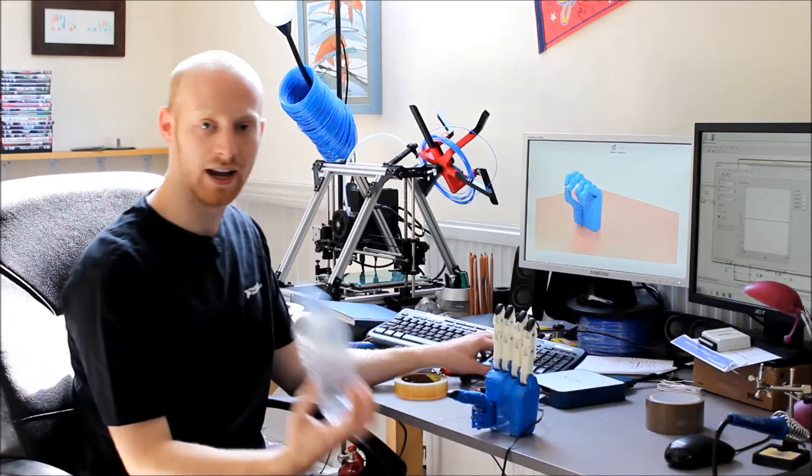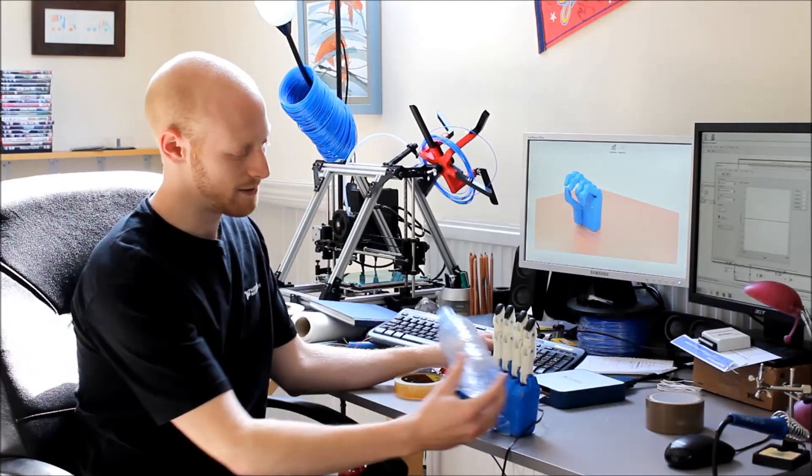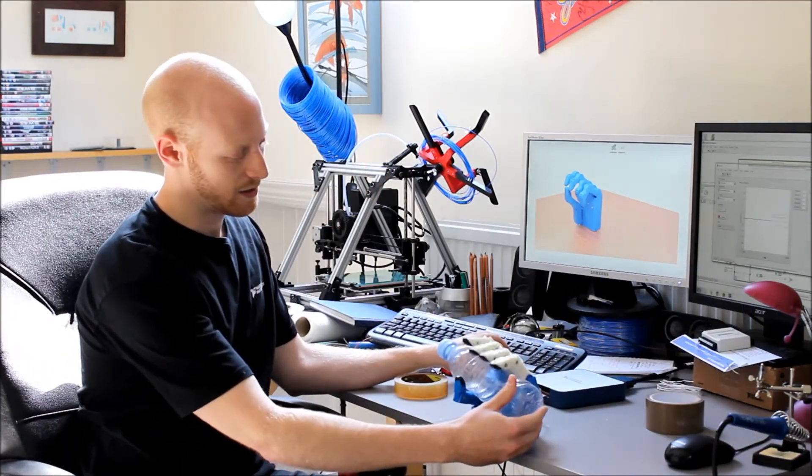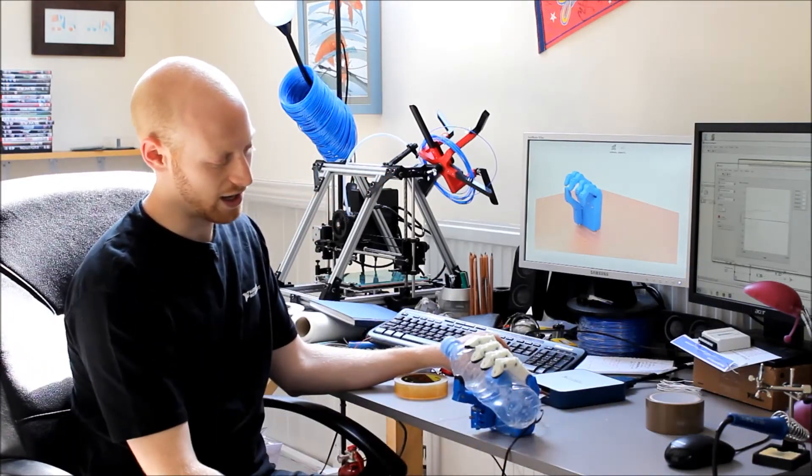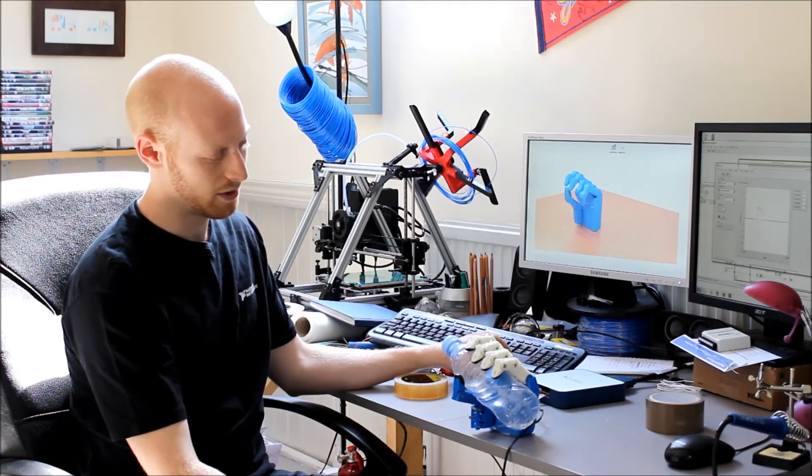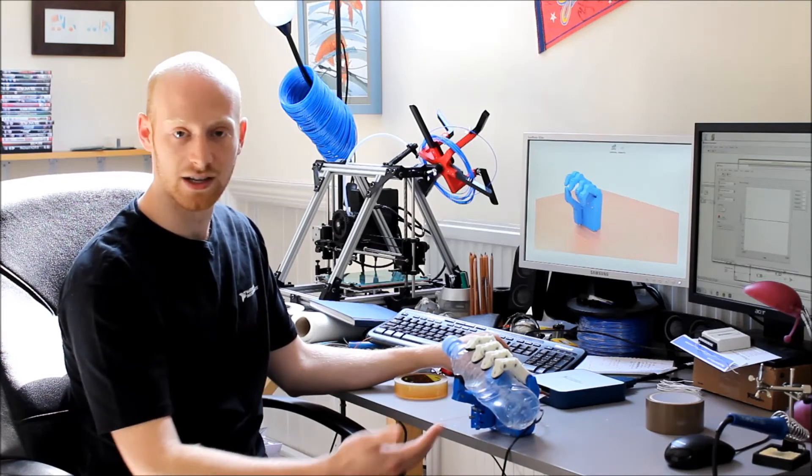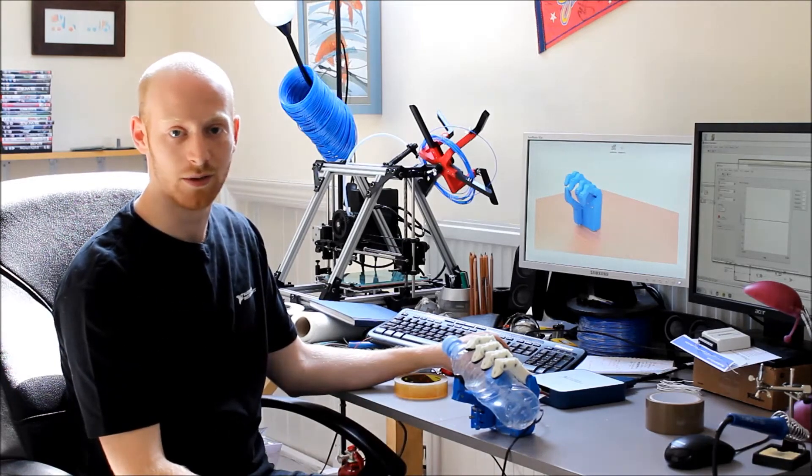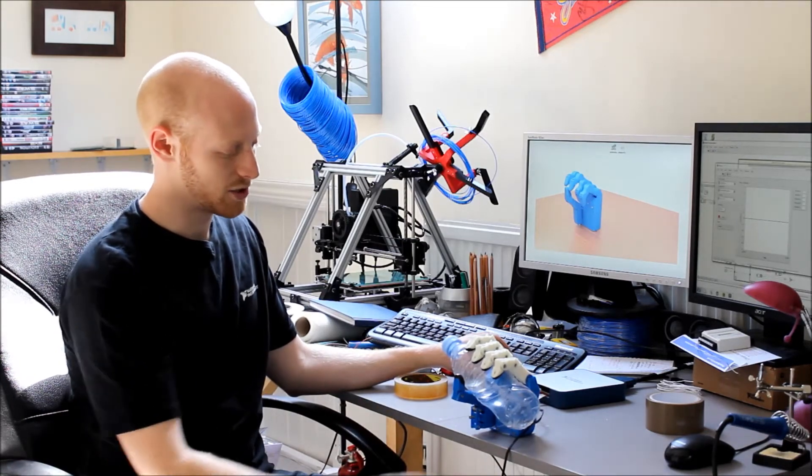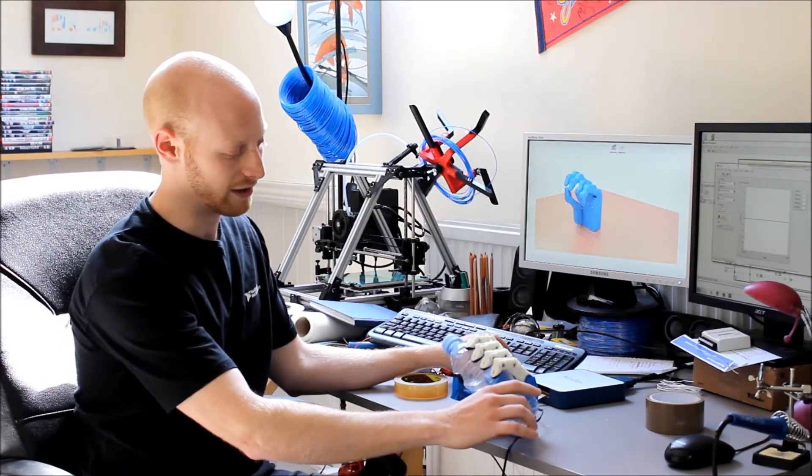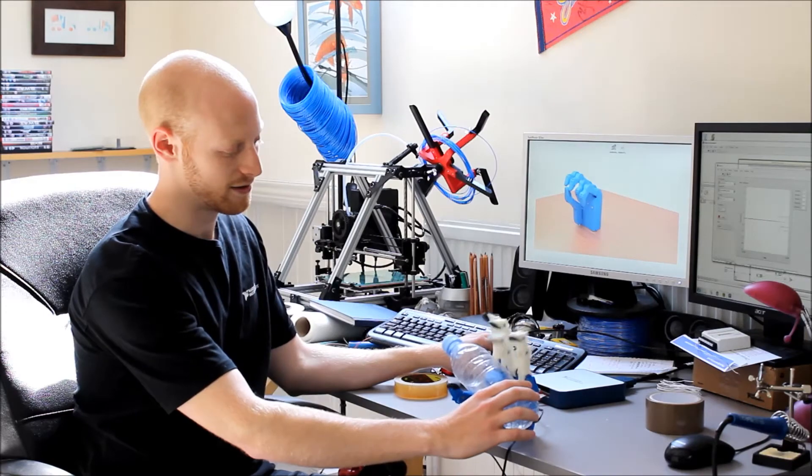Or if it's something cylindrical like a bottle, then you just see it will get a firm grip. All of the fingers are in contact with the object, so it's not moving very easily.